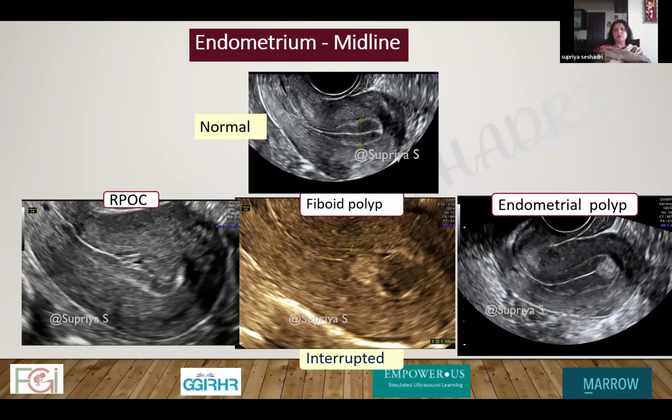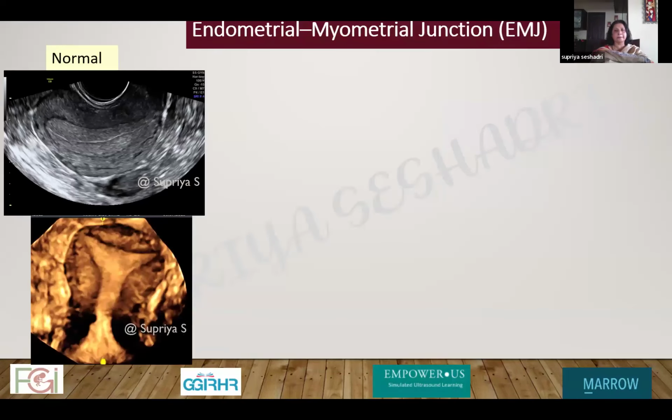because why is the midline there? The midline is there because in ultrasound, anywhere in the body, whenever two mucosal surfaces meet, they cast a white line. So this hyperechoic line that we see is because of two endometrial leaves or two portions of the endometrium coapting or touching one another, and therefore causing that white line.